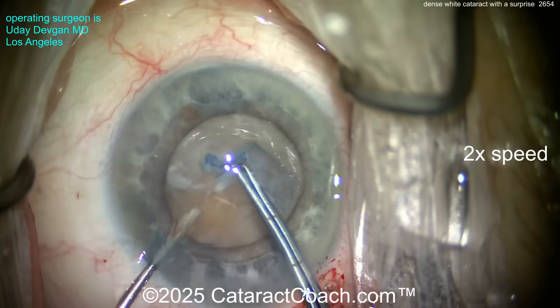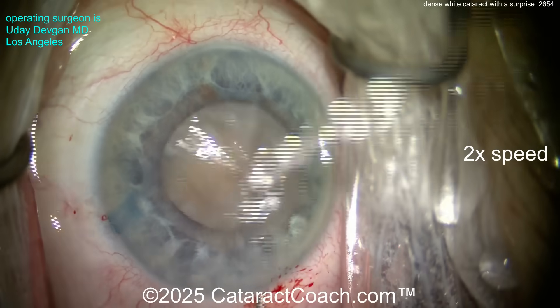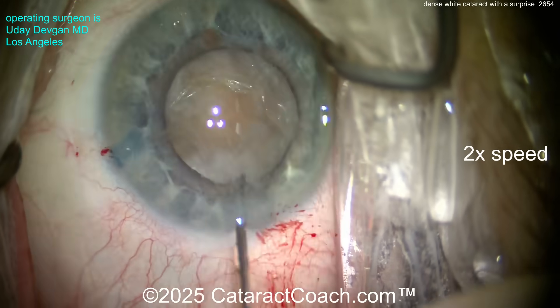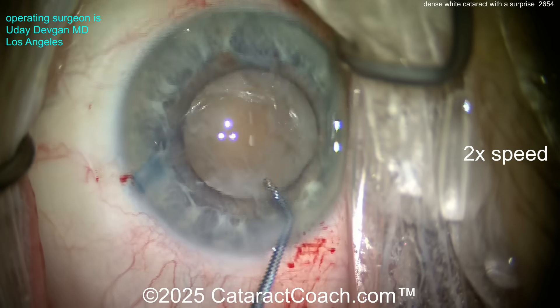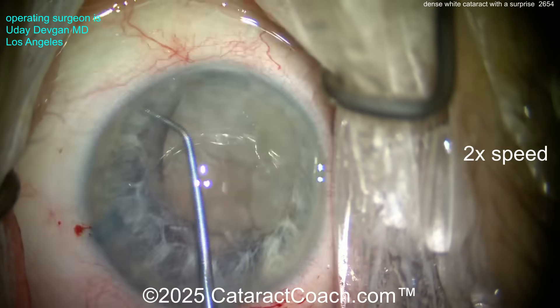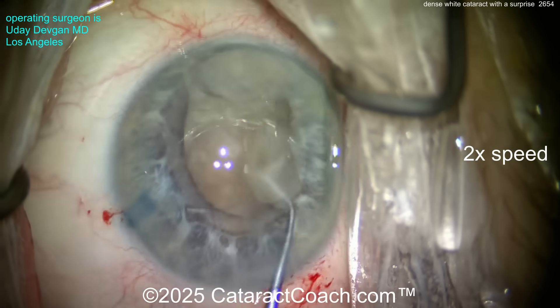Making sure we're all good — that looks pretty good. Get that out of the eye. Now let's do some phaco. Doing a little hydrodissection, but again this is a pretty dense nucleus. It does rotate, so there's not much residual cortex; a lot is liquefied. Now I'm going to bring the nucleus up — look at that, partially prolapsed out of the bag.